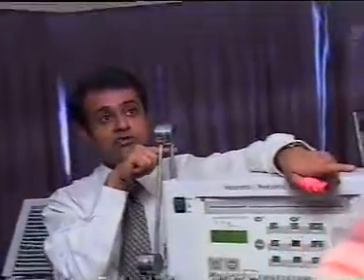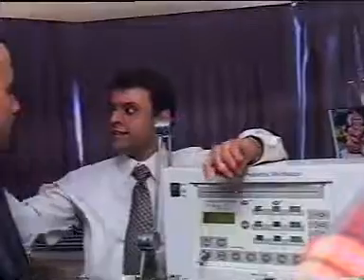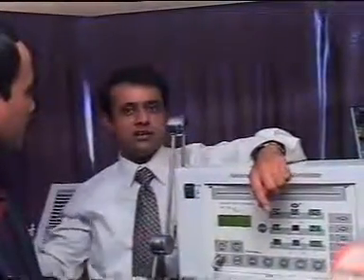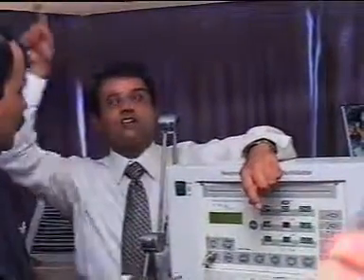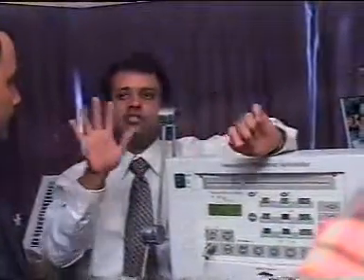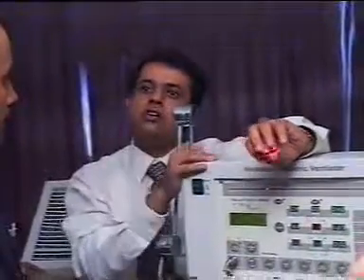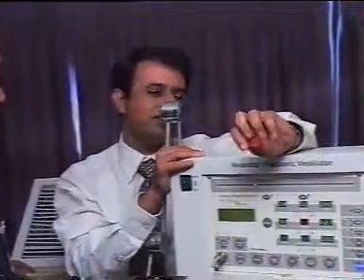So expiration में क्या होता है? कार्बन डाइऑक्साइड बाहर जाता है. क्या होगा? ऑक्सीजन तो वो मिल ही रहा है उसको, but at the cost of carbon dioxide भी मिल रहा है. So ventilatory rates, inspiratory time, expiratory time, I:E ratio are interconnected with each other. You got this? This is how, generally speaking, the settings affect oxygenation and carbon dioxide.